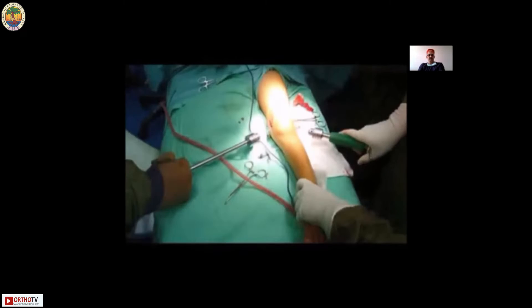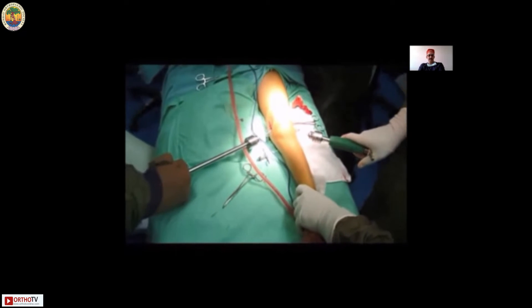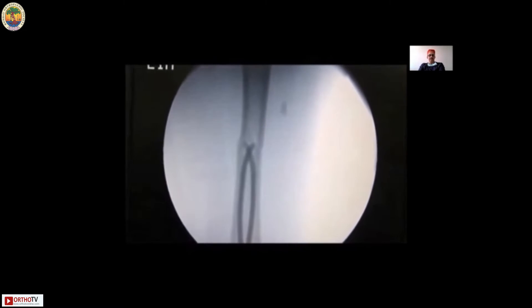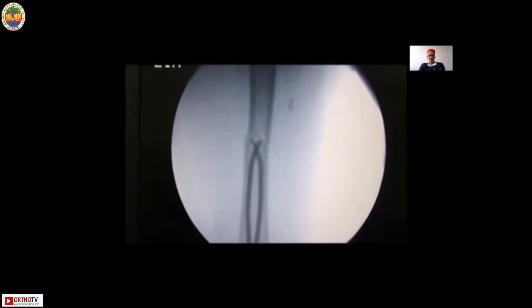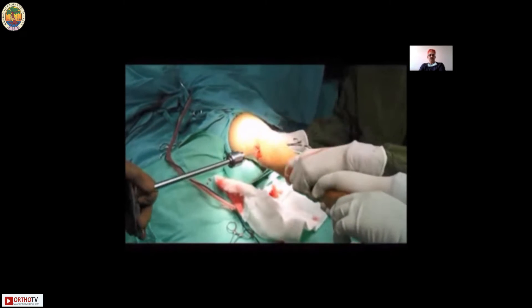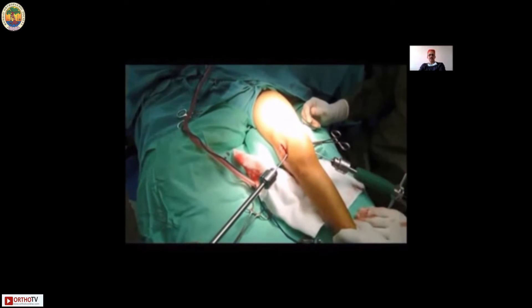Now both nails will be gradually advanced to reach the fracture site. Once they are at the fracture site, with linear traction you reduce it, then pass the nail into the proximal fragment. The nail which is easier to pass into the proximal fragment is usually passed first. Very often on the first pass the nail has not entered the canal, and what needs to be done is placing a bolster underneath the femur to restore the anterior bow, which corrects the posterior sag.